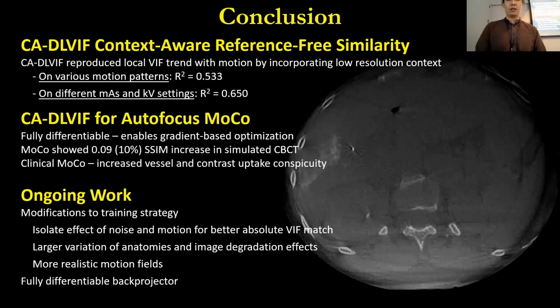And in our MOCO experiment on simulated cases, it showed good performance by increasing the SSIM value by about 10% averaged for our cases. And in clinical motion compensation, it improves the visibility of vessels and catheters.